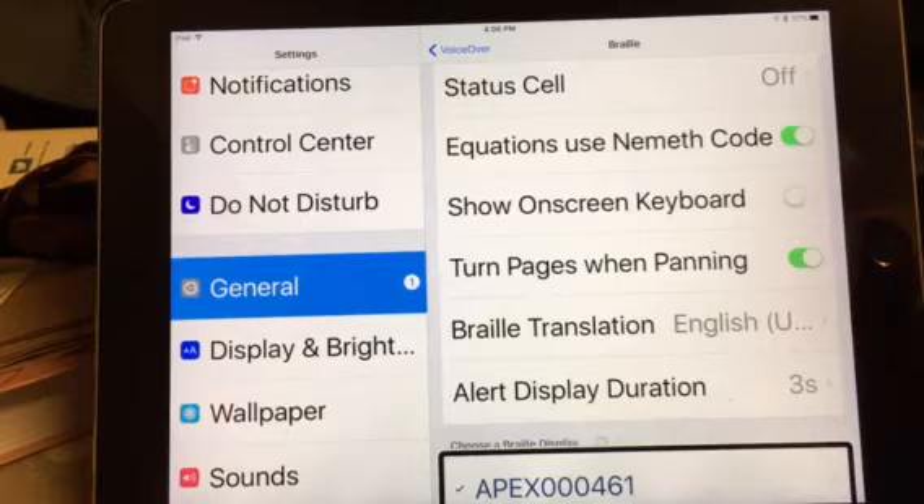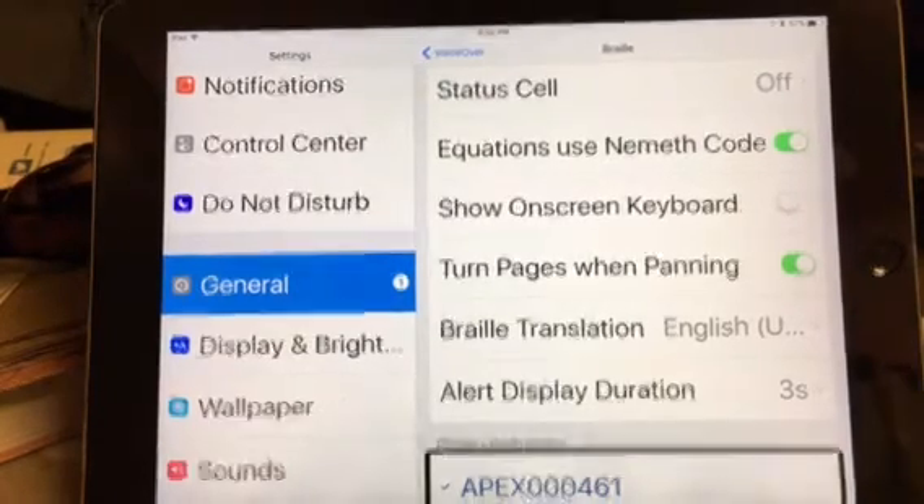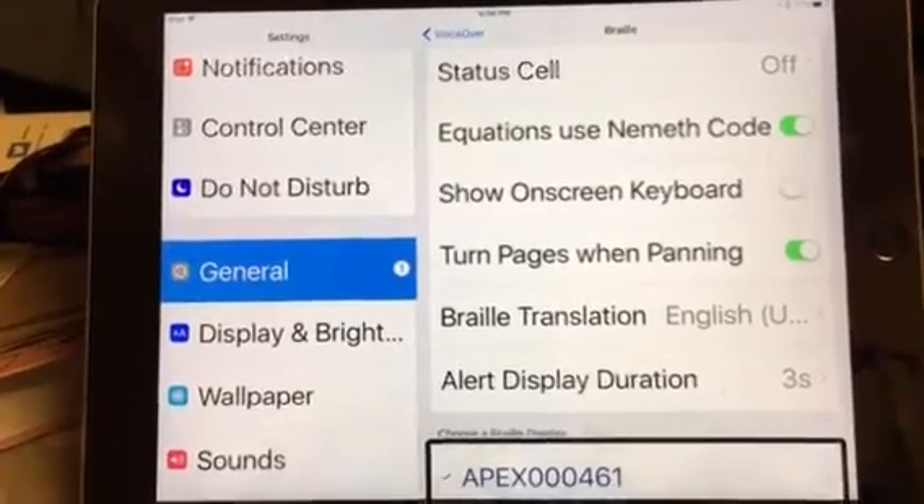Order is very important. If you have VoiceOver on before you connect it, it's not going to connect. It'll pop up with an error or it'll say unsuccessful or unable to pair device. I suggest paying close attention to that — I went through a lot of hassle trying to figure out how to connect it, and this was the easiest way to do it.